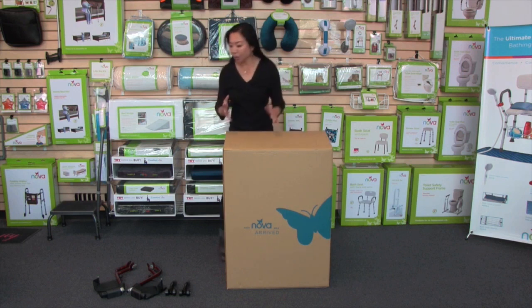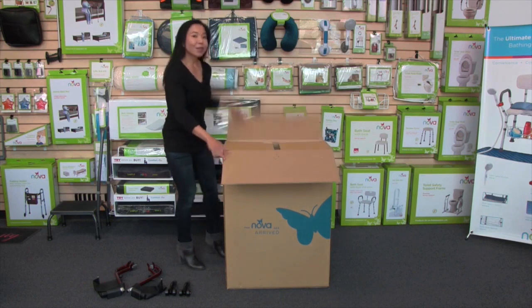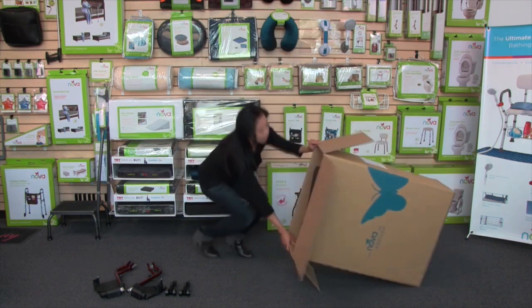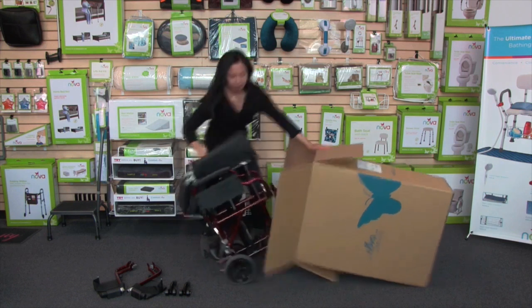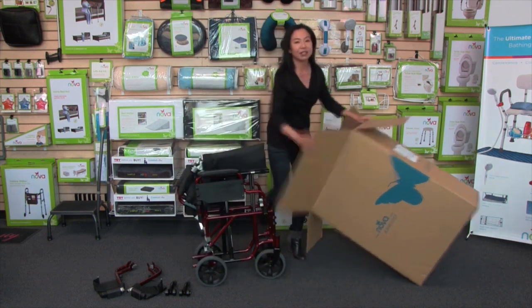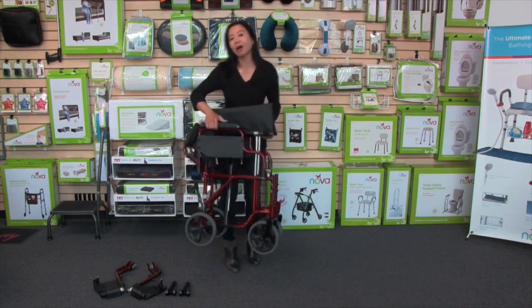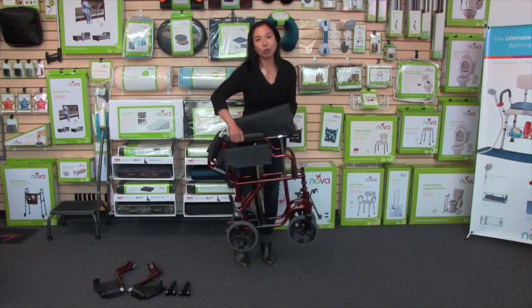First, remove the smaller box containing your footrests and your anti-tippers. Then what I like to do is turn the box on its side and you're going to roll out the transport chair — just like that, so much easier than lifting it out of the box. Your transport chair will come fully assembled. This is what it's like in a folded position — you'll see how compact it is when you're transporting it, and also it's so lightweight.